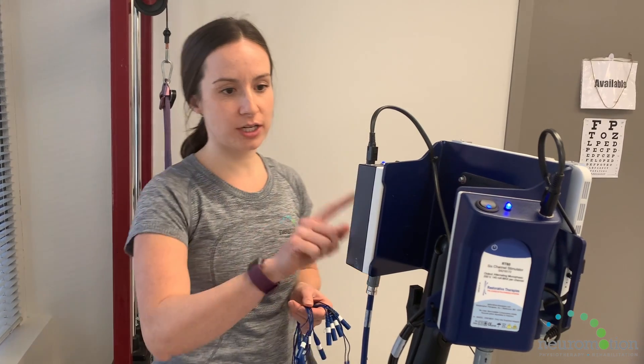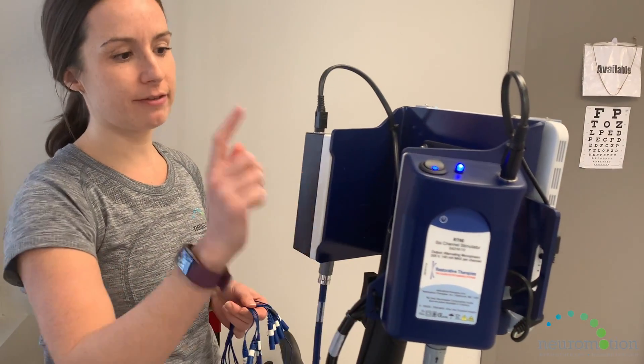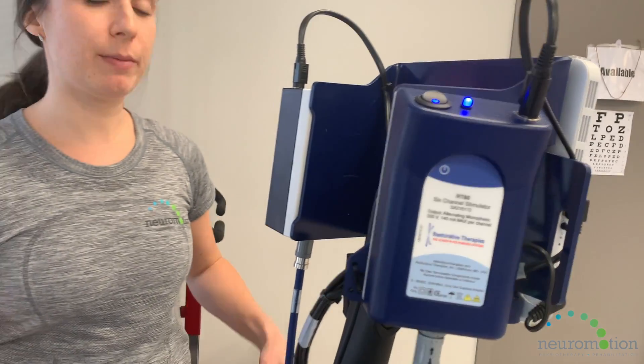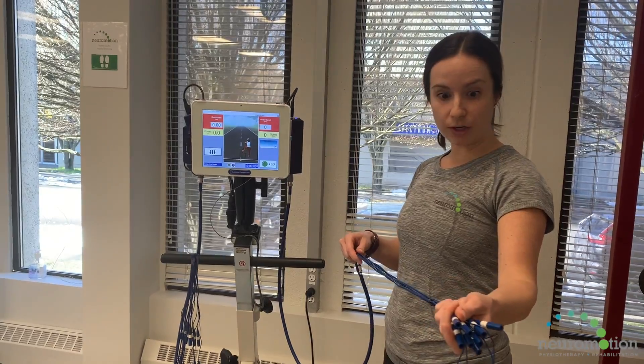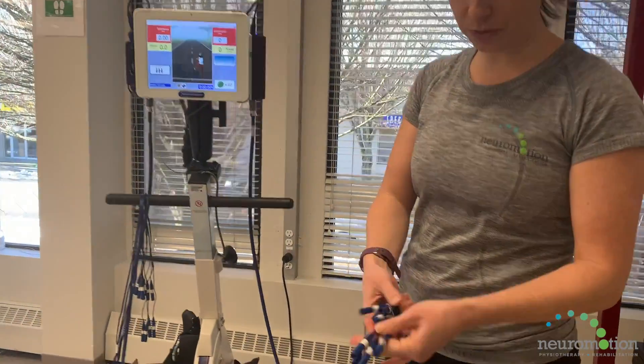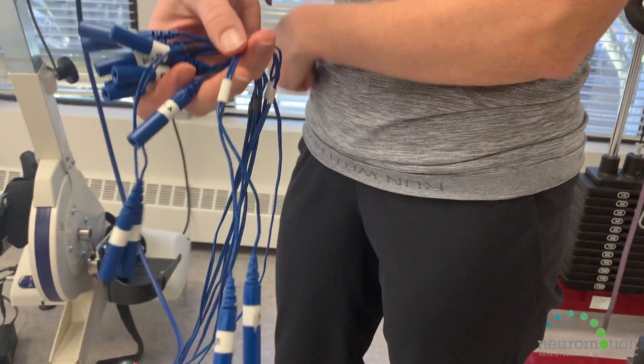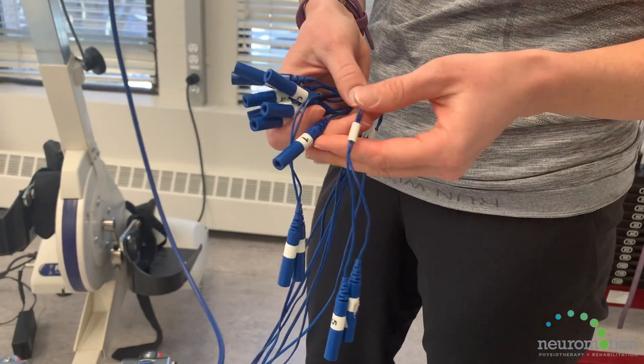We have two six-channel stimulators, so there's a left and a right. That means we can stimulate up to a maximum of 12 muscle groups — six on each leg. Then we have the cords, which go into each individual electrode to get plugged in, and this is how the electrical current gets into the muscle.